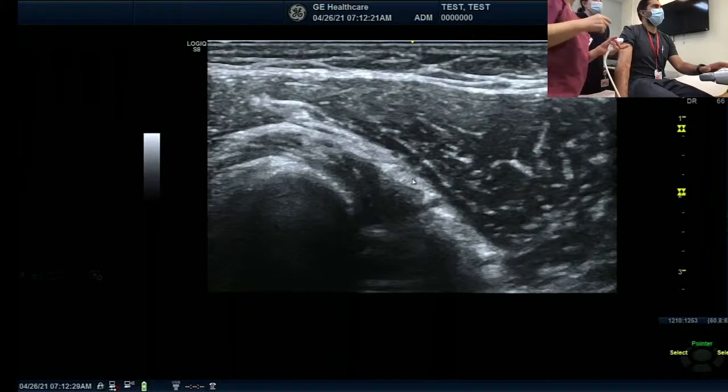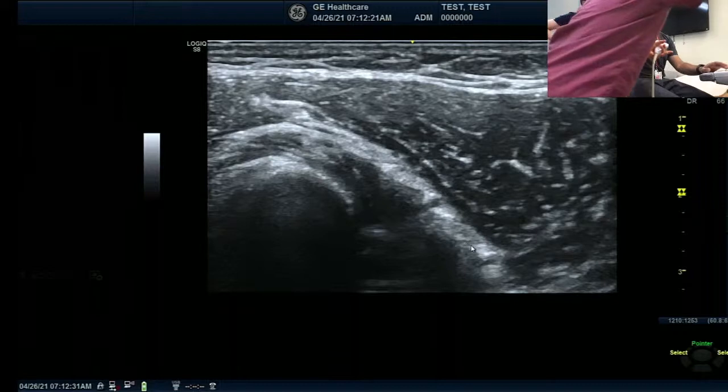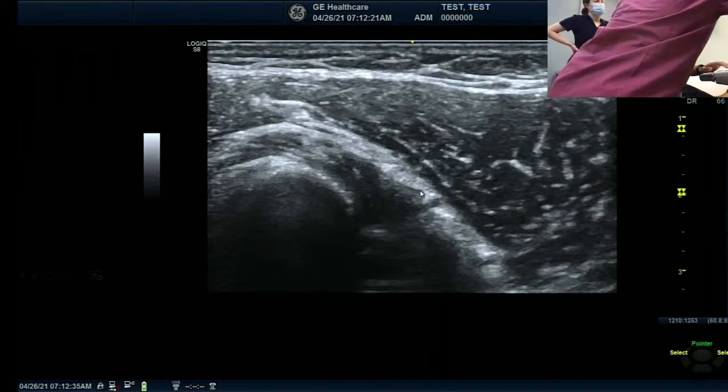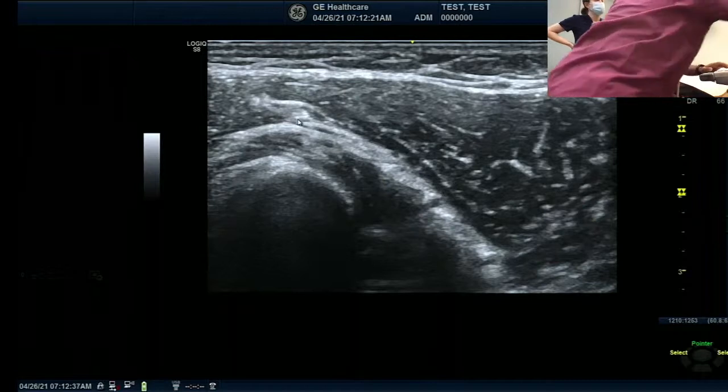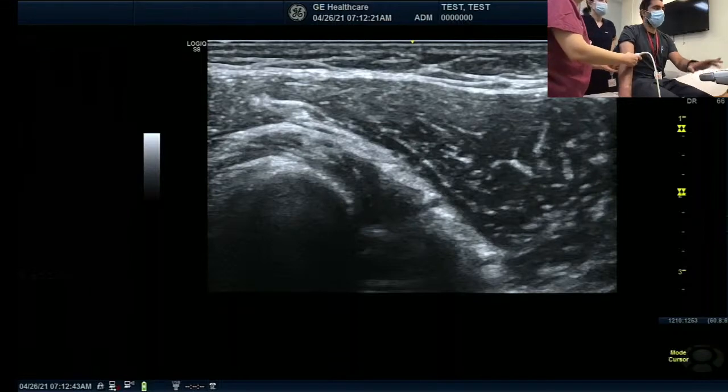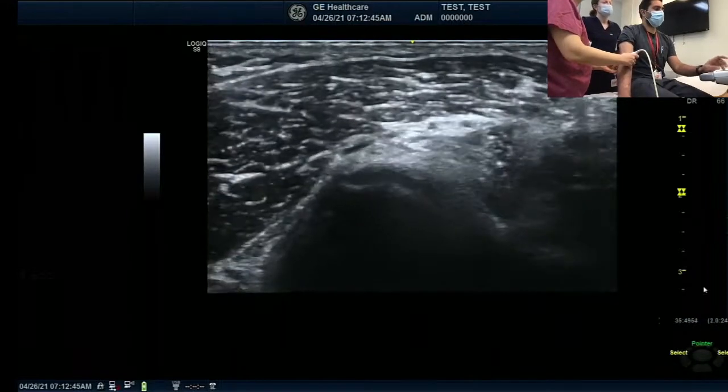That's the one. This point was the starting point. So we're going to double check so that you guys can follow the radial nerve along the supinator, right? Inside of the supinator, I'm sorry. Okay, let's go back. And then the deeper branch, let's follow.